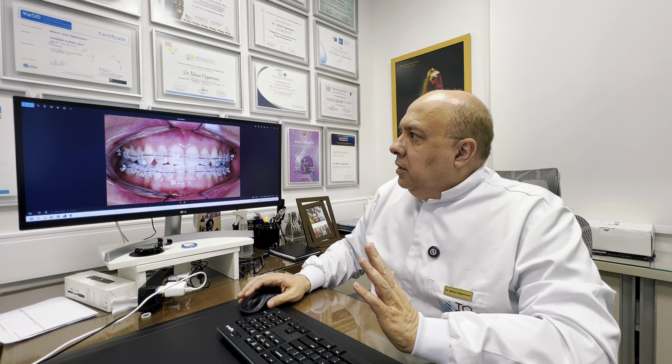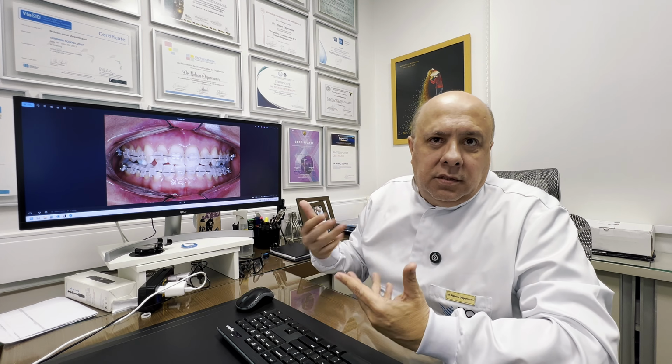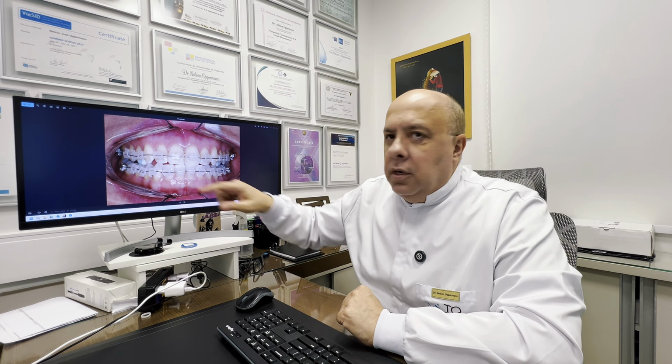Okay? Now, I am also able to mount the lower brackets, because I couldn't before. So this is the big difference to placing simple turbos here. If I put a simple turbo here, I don't know where I will put the joint. Where is the condyle when I add composite like in the mouth? I have no idea. And this is a symptomatic patient. I could never do anything directly in the mouth, a bite turbo, for example.